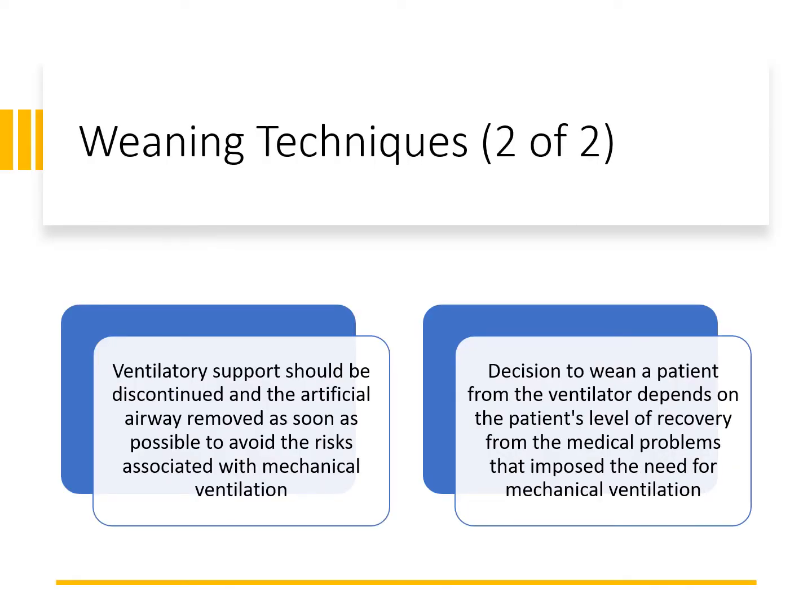All right, so techniques. When we're looking at this, there are several factors that we should consider if we're going to take someone off successfully, right? If we're going to take them off, let's make sure it's a success. First, do they require vent support during weaning? How much vent support do they need when they're weaning on their own? Second is how much oxygen and PEEP they're on. How much oxygenation are they requiring? And that's where you have to think about this patient's baseline.